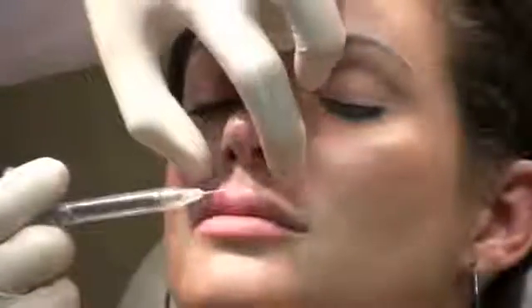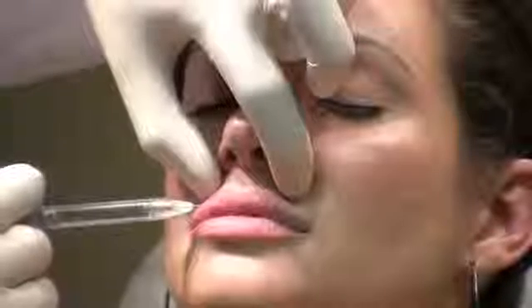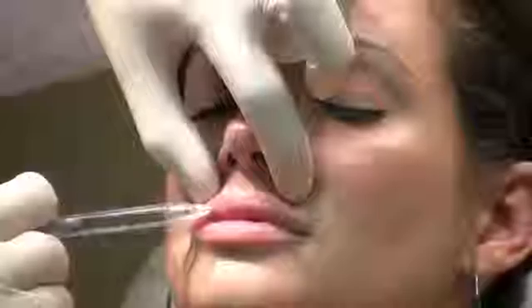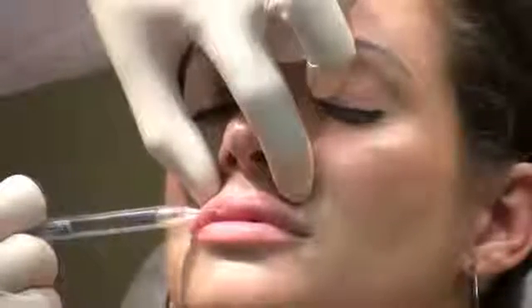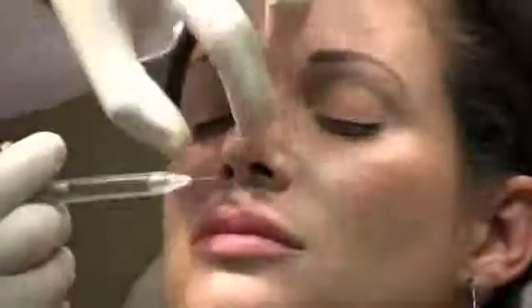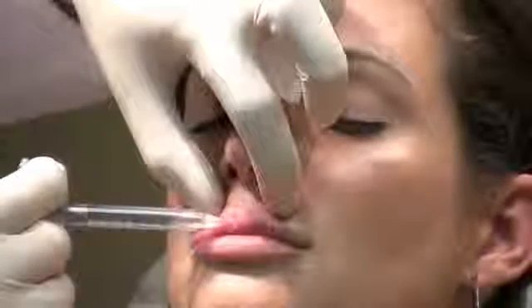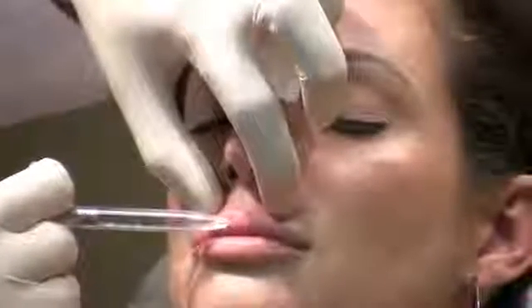So the penetration and filling is from both sides, as you enter and as I pull back. Now, as you can see, she has a very nice lip roll, which means I really see her red lip nicely. This is partially because we've actually injected it before in the last few months. But with this type of lip, I don't need to inject the vermilion border, which is the border between the red and white. If I wanted to get more of a roll, I would do it slightly differently. The take-home message is every lip is different, and the injection has to be done differently.